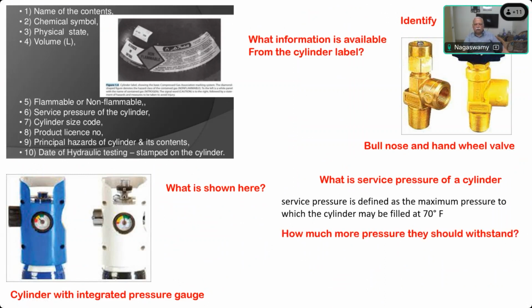How much more pressure can they withstand? They should withstand more than the service pressure. How much more should they be able to withstand so that no explosion occurs? Not 3 times, 1.66 times the service pressure. Slightly more than 1.5 times. So 1.66 times the service pressure is the maximum pressure they should be able to withstand.